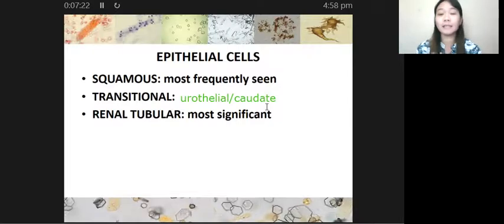Alright, so from the term itself, transitional or your urothelial cell, okay?